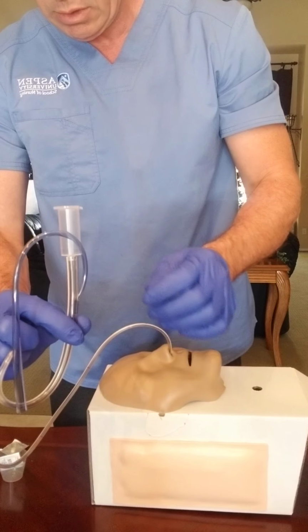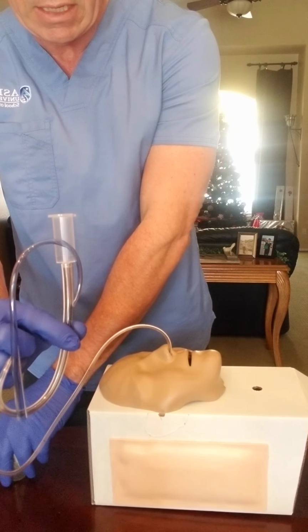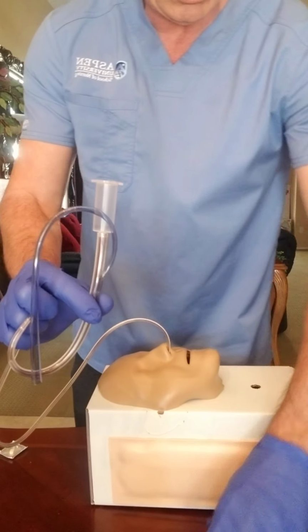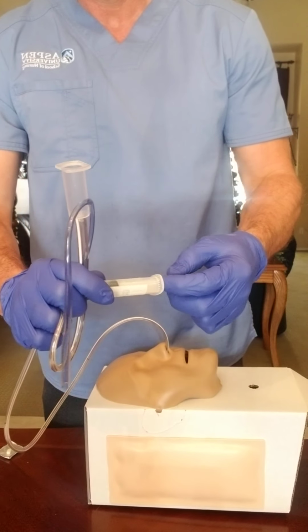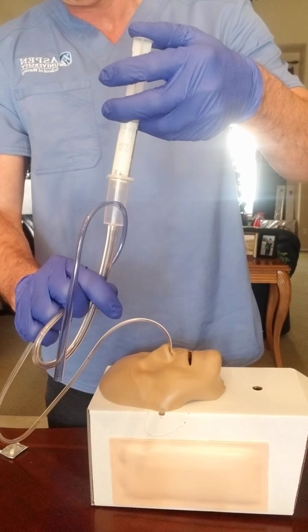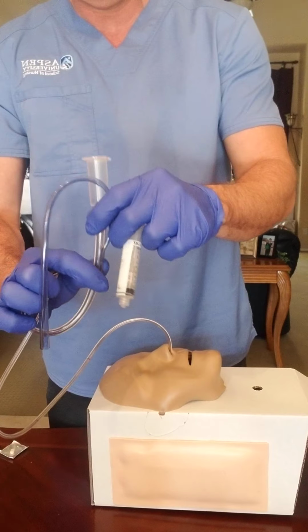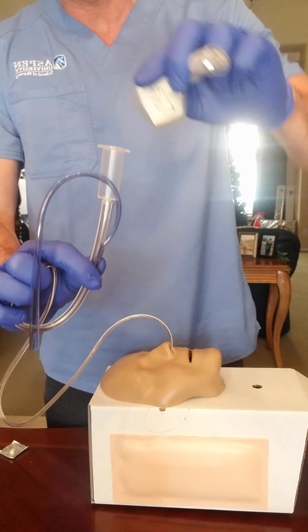And then once that's done, I will do the second medication, and I will pour 10 ml of water, let that flush again, go all the way down. That's done.